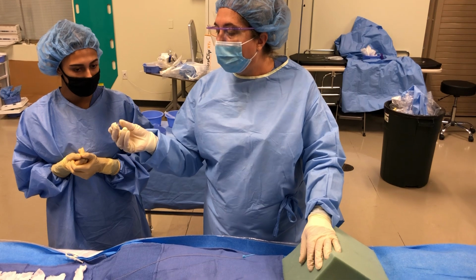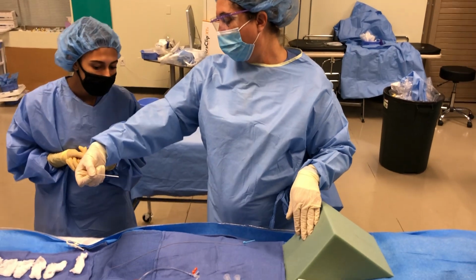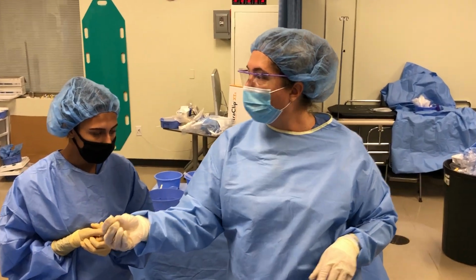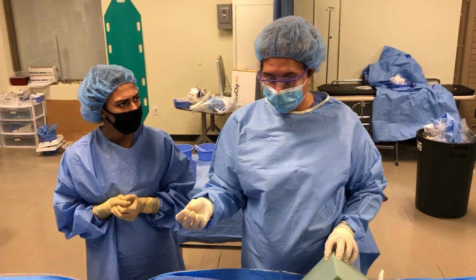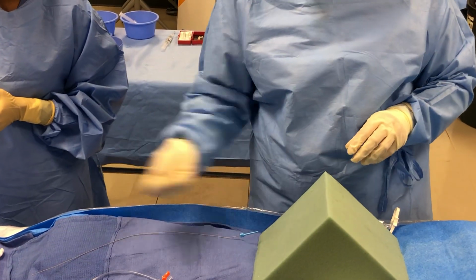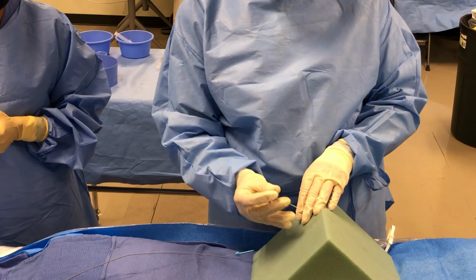This needle needs to be bevel up. So remember, the bevel is the hole, the open hole, right? So that's bevel down, that's bevel up. You can actually see the hole. Does anybody remember at what angle we need to go into the patient? 45? 30 to 45. So a 30 to 45 degree angle. So we don't want to go straight up and down. We don't want to go completely flat against their skin. About a 30 to 45 degree angle they're going to go in, okay?